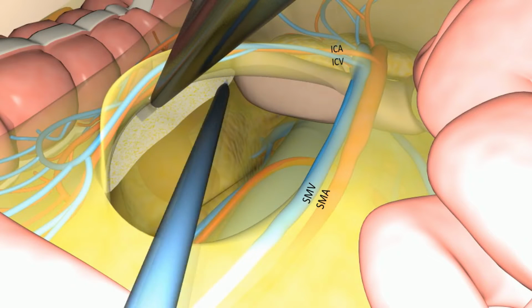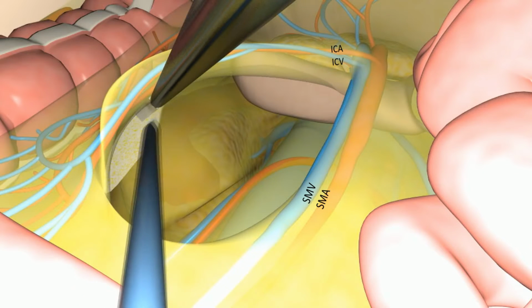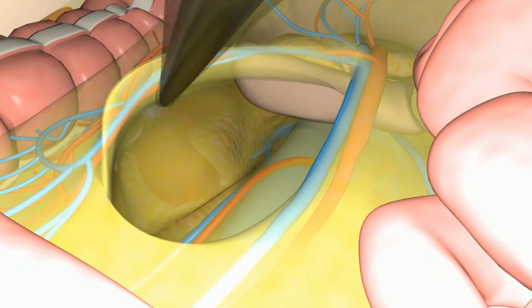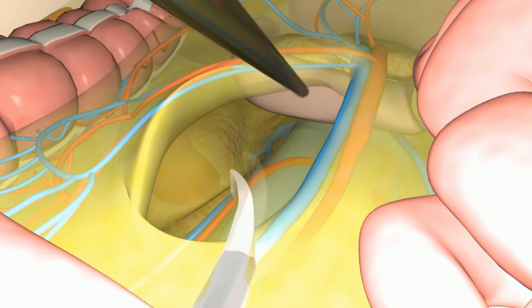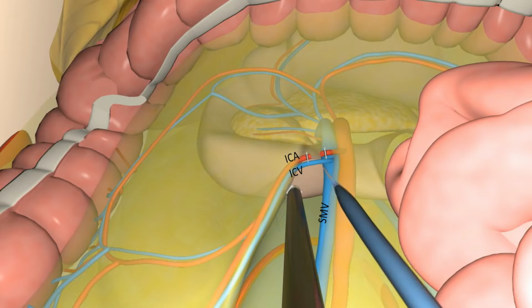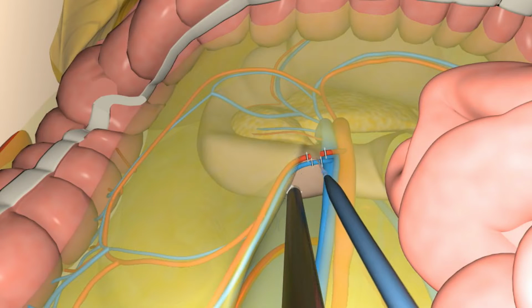Blunt dissection is then used to lift the vessels away from the retroperitoneum, opening the plane cranially up to the origin of the ileocolic vessels from the superior mesenteric vessels. Then, the ileocolic artery and vein are dissected separately and ligated respectively.